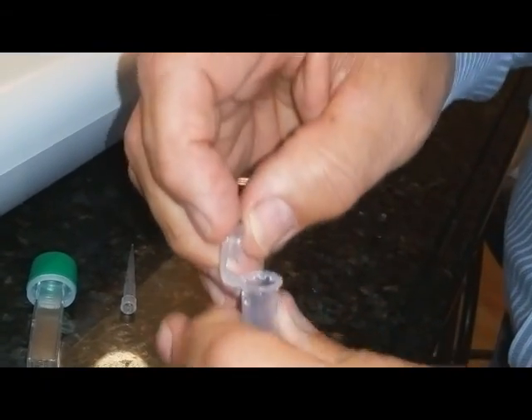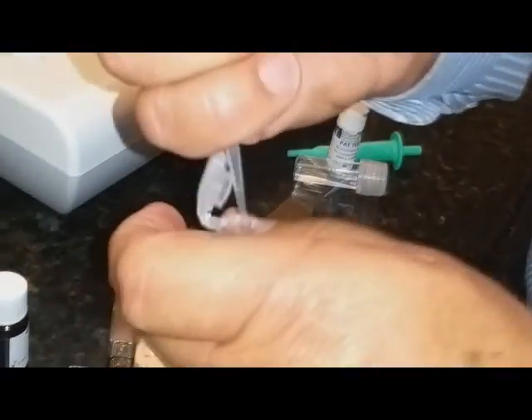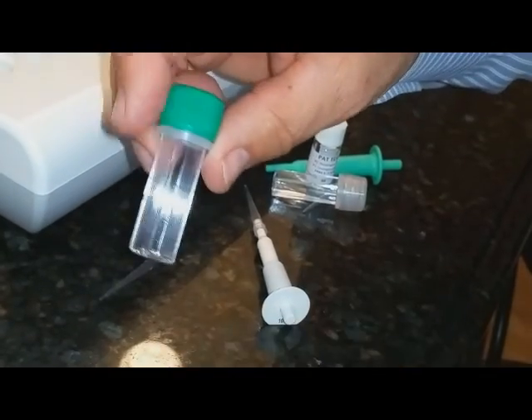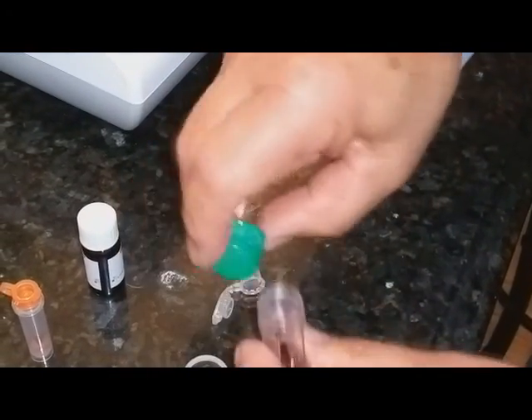That goes into the little container and we agitate for 10 seconds. Now I'm going to get 10 microliters of plasma using a different micropipette — there's 10 microliters of plasma — and that goes in here as well. That gets agitated for 10 seconds, and then we're going to put it in our cuvette to go into the colorimeter. These are not easy to open — a little security ring will come off — and now we can pour this in.